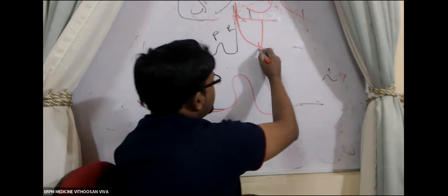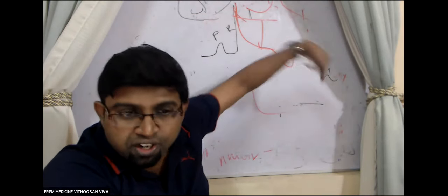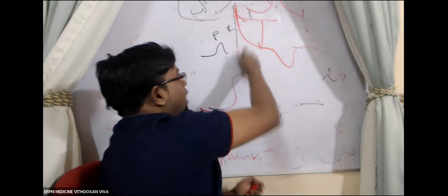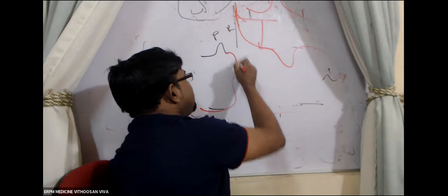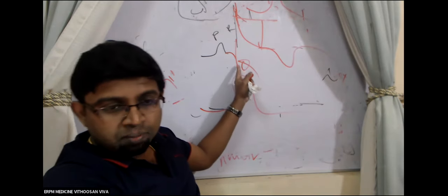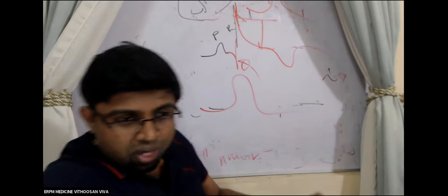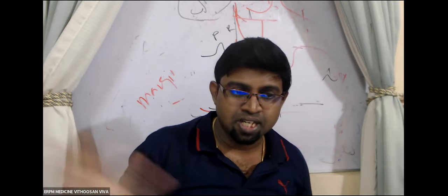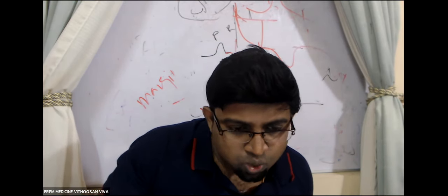Right? So later your T waves will become inverted, like this. If you don't treat the patient, sometimes he can develop something called a Q wave, a negative wave, here. The mechanism of this we study in the cardiology theory class, and in the Viva class and the emergency class we'll discuss. I just want to tell you that to start all this, just to revise your theory knowledge.